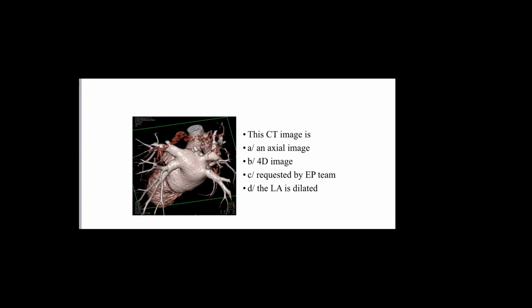Cardiac CT is requested by EP to map the anatomy of the pulmonary veins prior to ablation. This is so important because they need to know exactly how many and the ostia and the entrance so they ablate fully and completely without residual miss. Now, if there is a supernumerary vein, for example, they might miss it if you don't tell them. So a CT will provide them with enough data to decide about the amount of ablation and the completeness of ablation. Okay, so this is important.